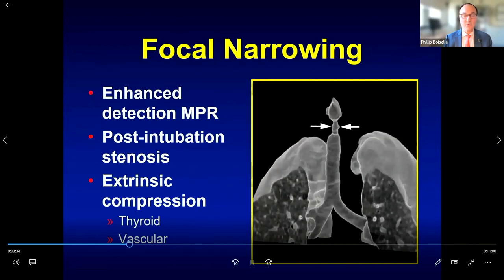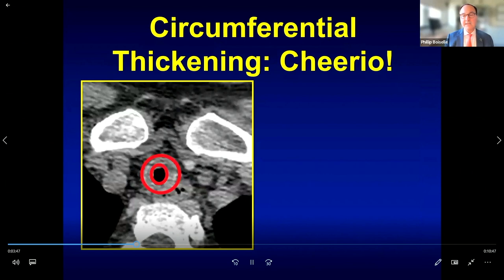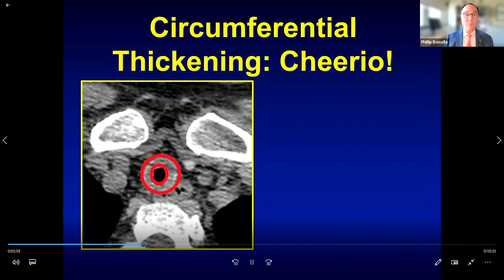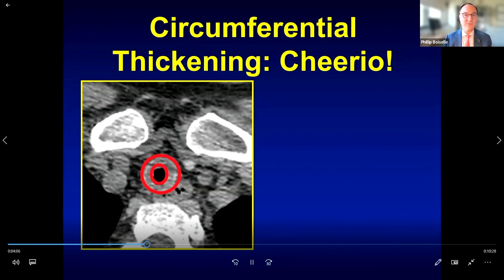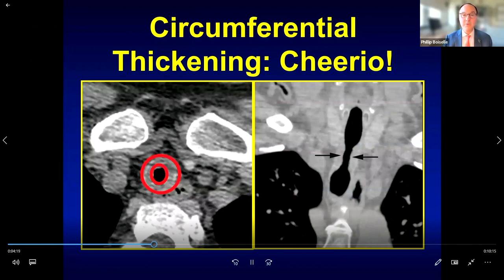Here is an example of focal intrinsic narrowing, and here is extrinsic compression from an enlarged thyroid gland rendered in red. Also look carefully at the tracheal wall thickness — the normal wall is about one to two millimeters. Circumferential wall thickening creates a 'Cheerio' appearance, and on multiplanar reformation we see an hourglass configuration, which is very typical of post-intubation stenosis.